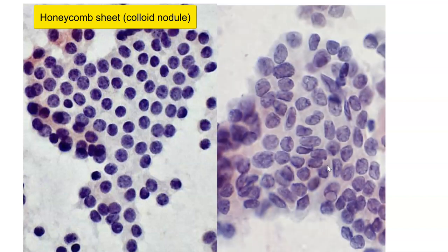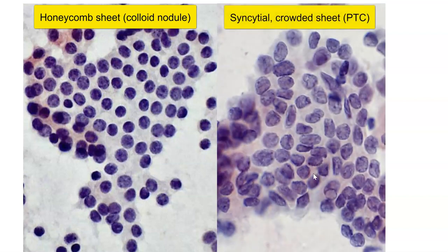In contrast, here is a syncytial sheet of cells taken at the same magnification from a case of papillary thyroid carcinoma, where the nuclei are much larger and more oval in shape. You can see very pale, powdery chromatin and also prominent nuclear grooves. So this is a nice classical example of papillary thyroid carcinoma. And over here, we can actually see an intranuclear pseudo-inclusion. Thank you.